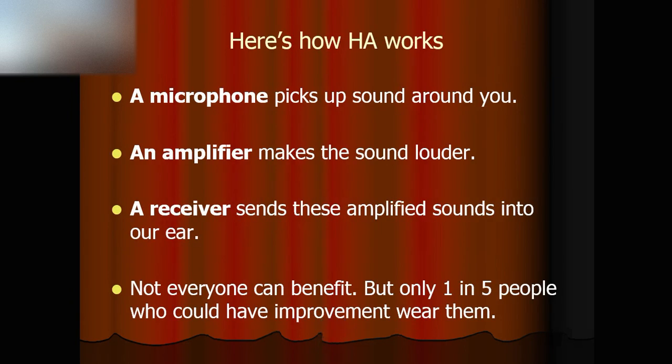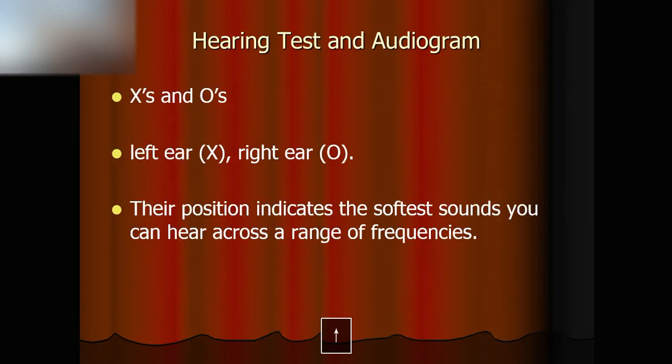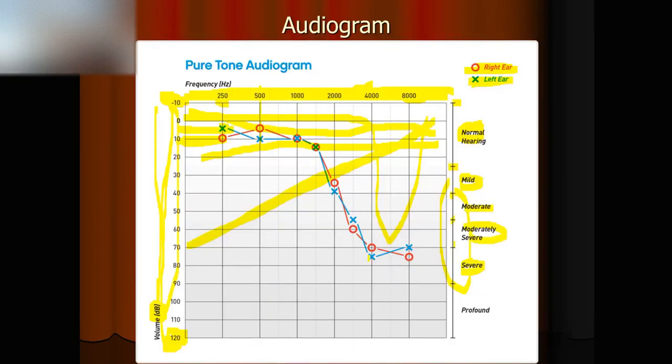And another thing is an amplifier that amplifies sound louder. So to be more specific, a hearing aid is not to amplify a sound, but to amplify what? Yes, amplify some components of a sound. A sound has many components. Each component is located on a particular frequency. So a hearing aid is essentially improving the amplitude of some components on some frequency.